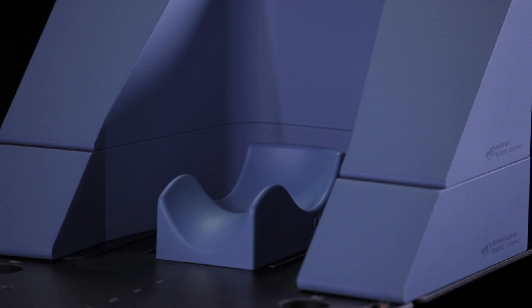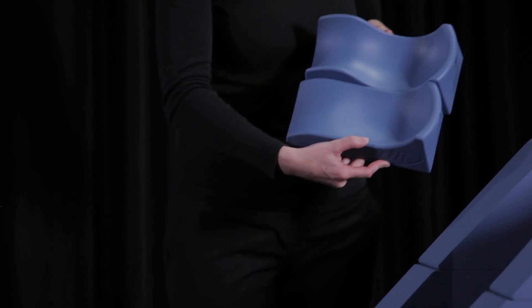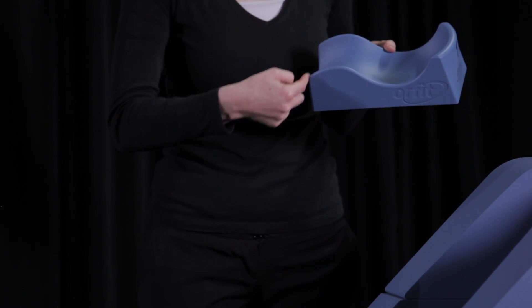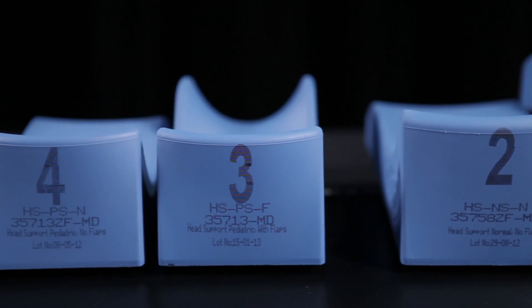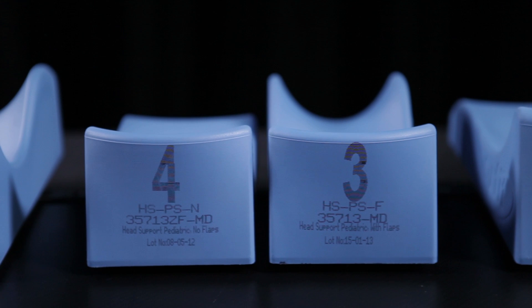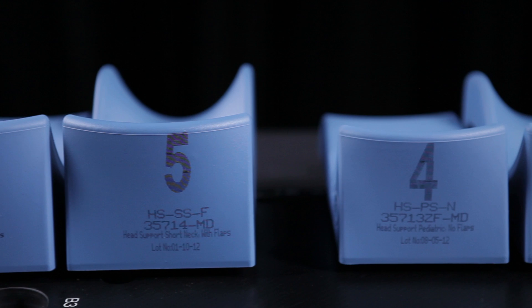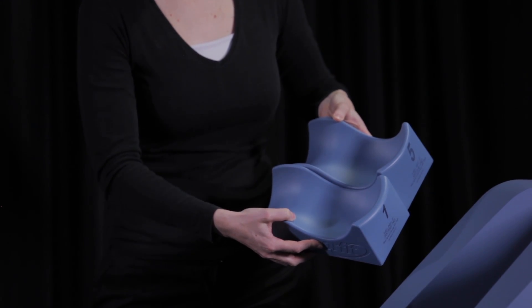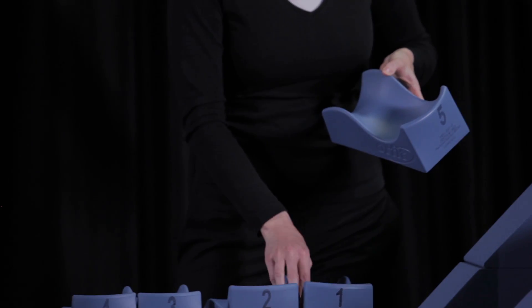Models 1 and 2 are the standard head supports. Support 2 differs from head support 1 in that it doesn't have lateral neck flaps. Head supports 3 and 4 are the standard paediatric models. Head supports 5 and 6 are as big as supports 1 and 2, but slightly shorter in the neck section. They are used for patients whose head is closer to the shoulders without a distinct neck.